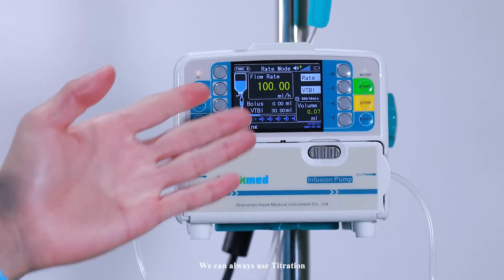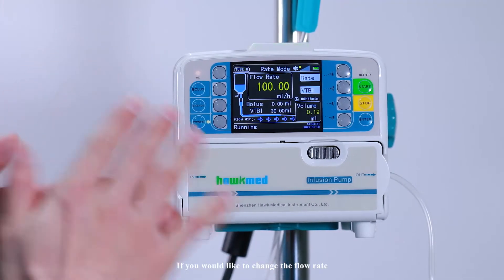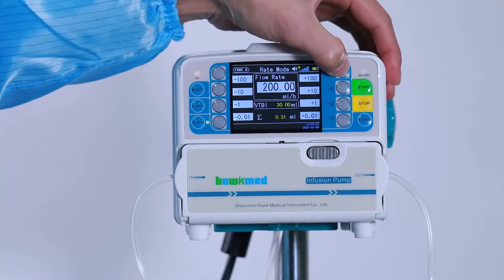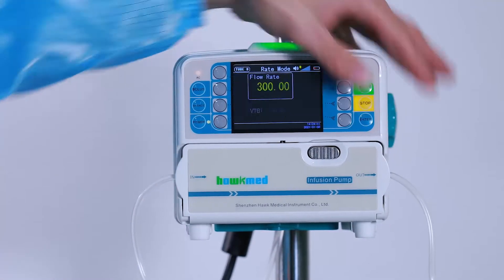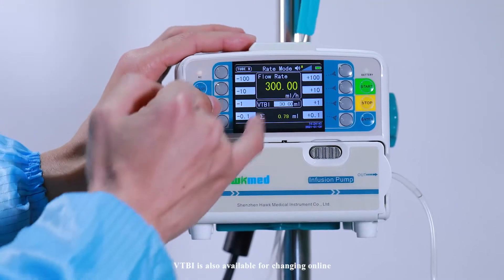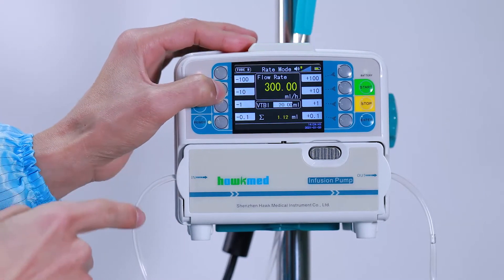We can always use titration if you would like to change the flow rate. You can change it while the pump is still running. VTBI is also available for changing online — press Enter to confirm.